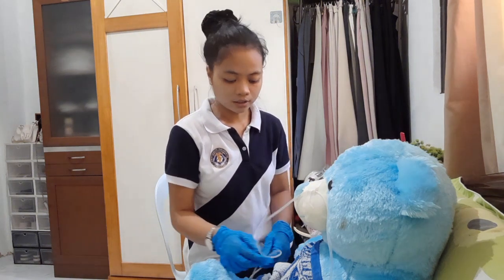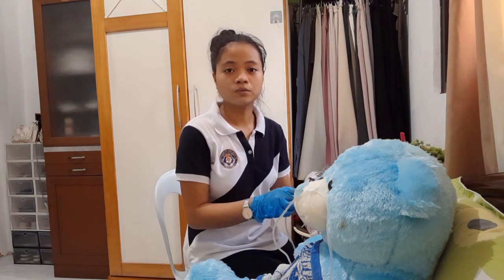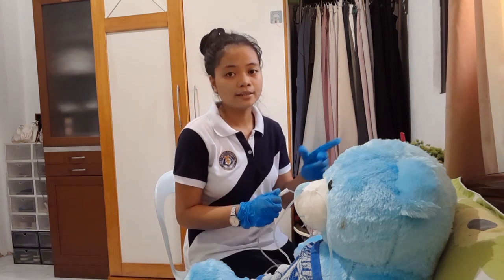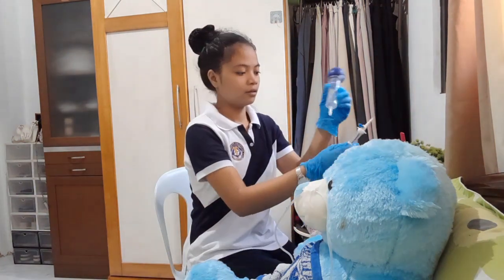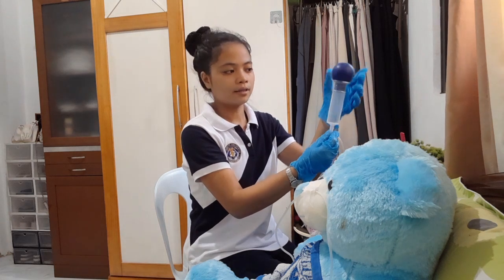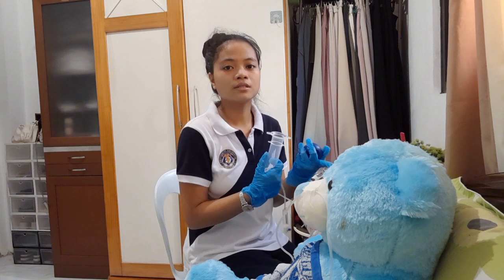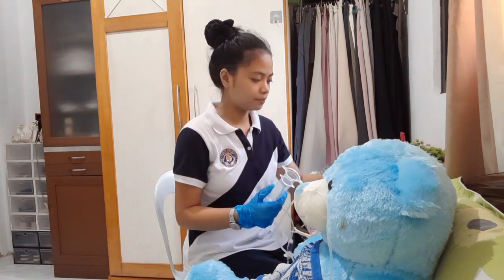Then we're going to connect the tube to a drainage or specific suction or if feed is ordered. So, ganito po yan. Kapag may order na may feeding. So, we're going to put it here. Then, remove this. Then, fasten the tube loosely to the client's gown with a safety pin.